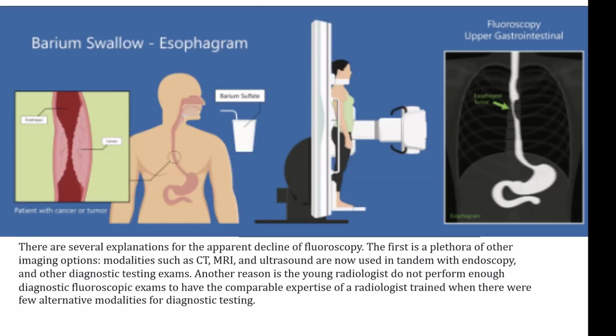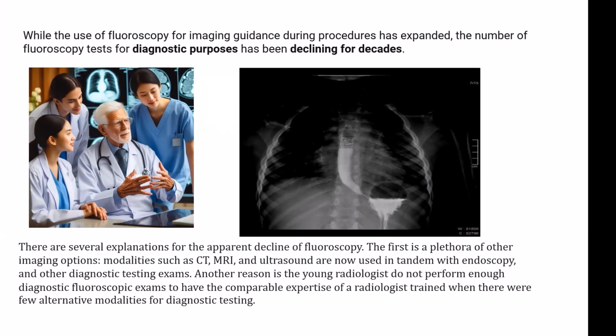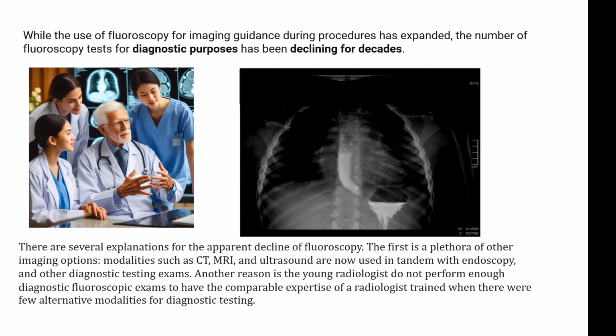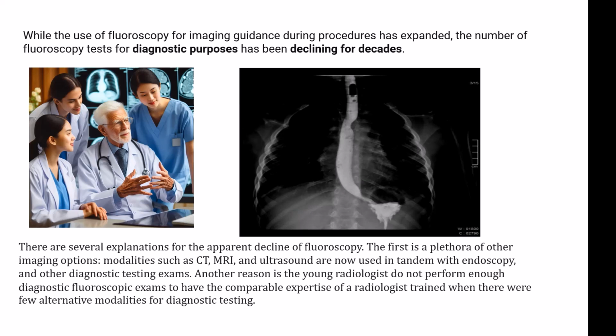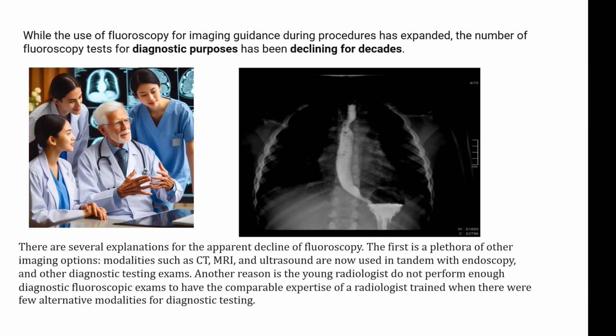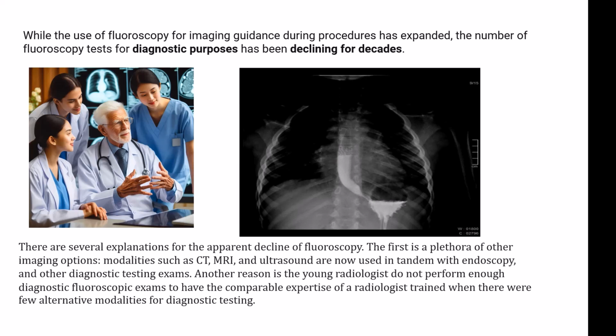Fluoroscopy remains a valuable modality even in the age of high-resolution cross-sectional imaging modalities. The benefit of diagnostic fluoroscopy is its ability to obtain a real-time evaluation with true temporal resolution, including the ability to reposition a patient during the exam. Diagnostic fluoroscopy also provides the ability for focused and functional examination of a particular region of interest.